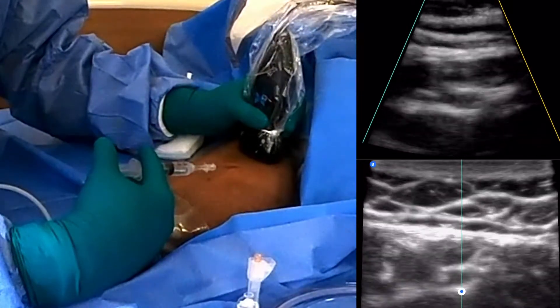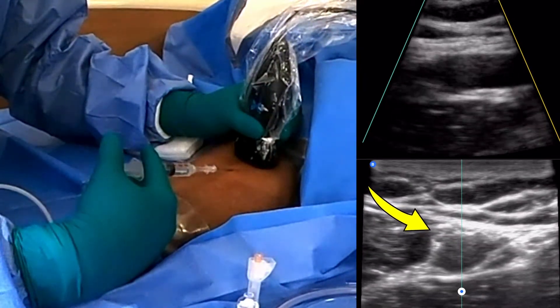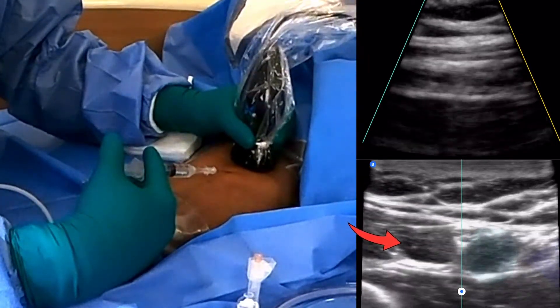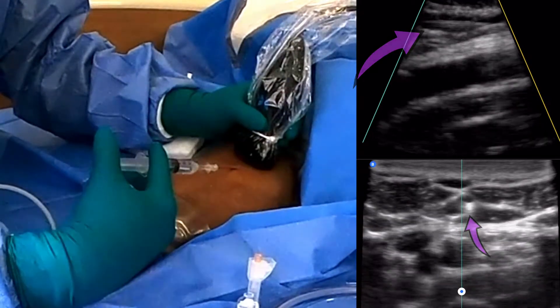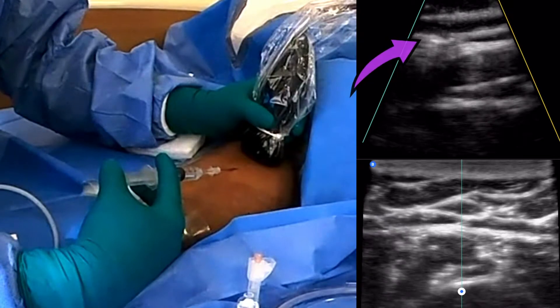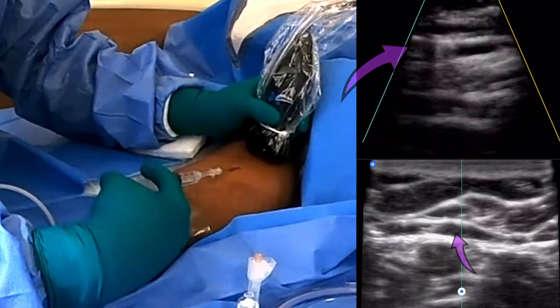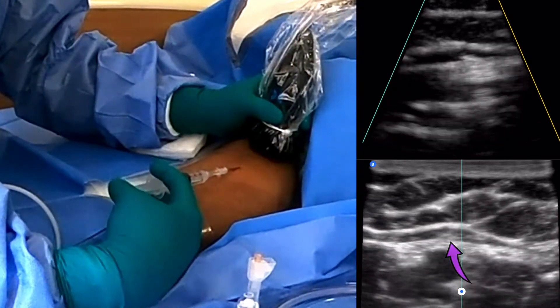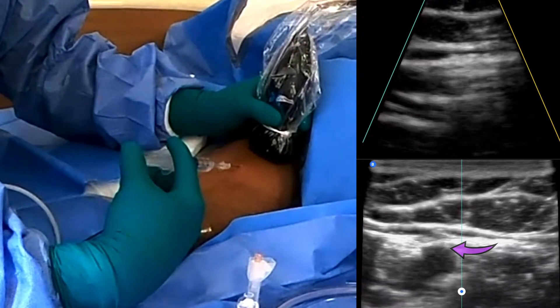Now let's give it a little more distance. We've got plenty of room, plenty of space. He's got a small nerve bundle to the top left of the artery — non-compressible but maintaining its circular structure right above the artery. It's pulsating a little bit — definitely a healthy guy. The vein is on the right of it. If you lose your needle point, look for the shadow — it'll be a little bigger than a regular needle point, and where it disappears is where your needle point is. I'm keeping a lower, shallower angle for more tissue and space between the vein and the insertion site to decrease infection risk.